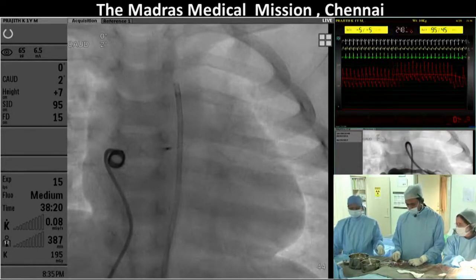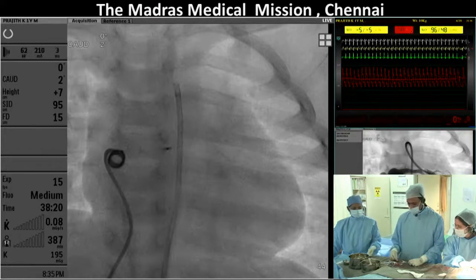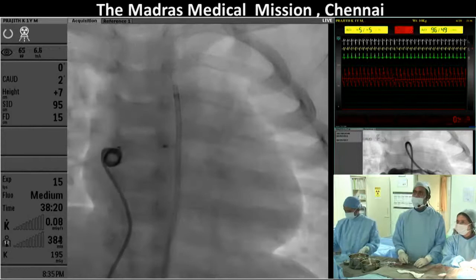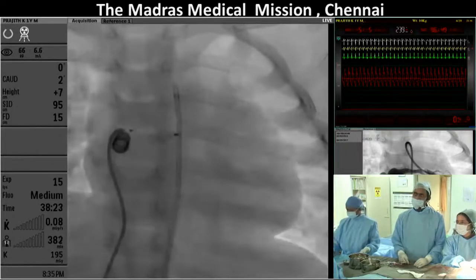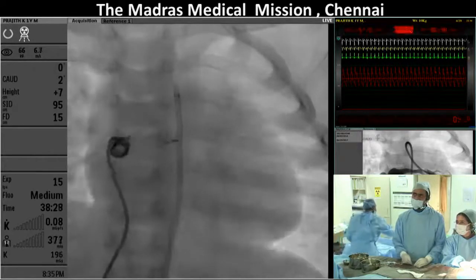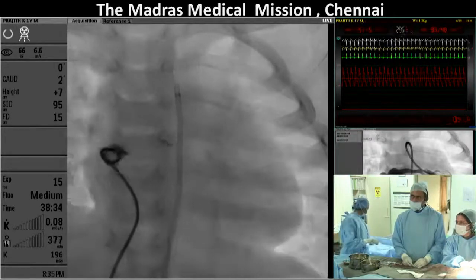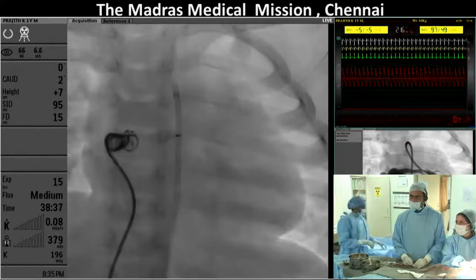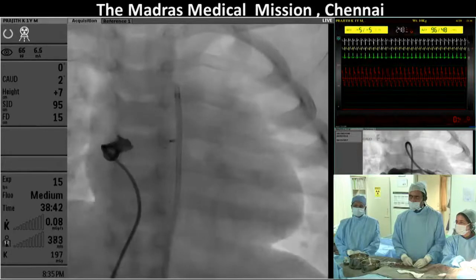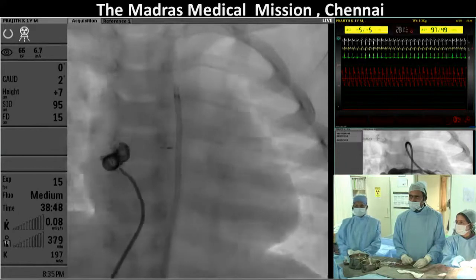My question was that since you have occluded the proximal entry into the fistula sac, why are you now wanting to fill up the sac? I feel that the sac should collapse once the... It may collapse, but it can stay patent. I've got an example of that. If you close it distally, I can understand, but if he has closed it proximally towards the circumflex, as in this case, and leave the aneurysm opening into the right atrium, the right atrium somehow keeps filling that aneurysm. What has been your experience, Jim? Or you have been always closing the sacs? I don't always close the sacs, and I'll be honest.